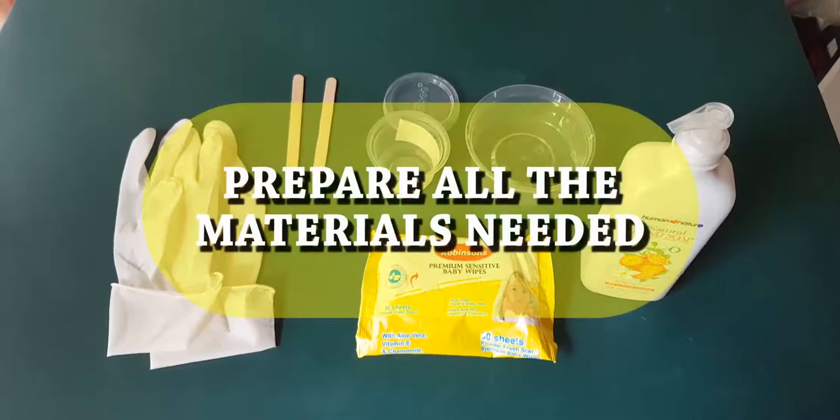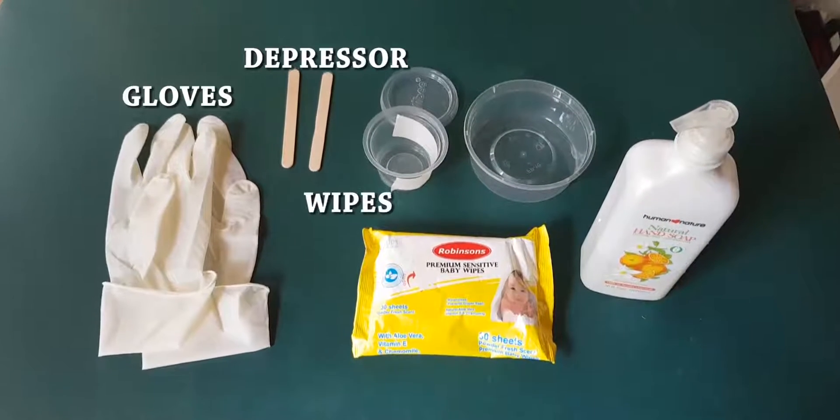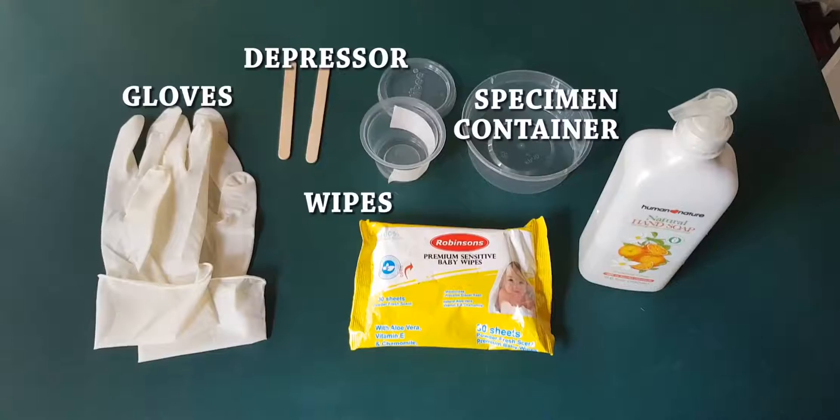First, prepare all the materials needed: gloves, depressor, wipes, specimen container, and soap.